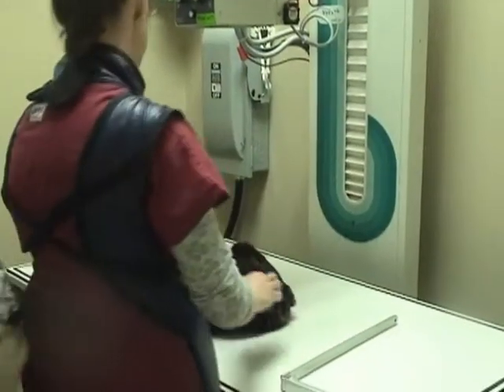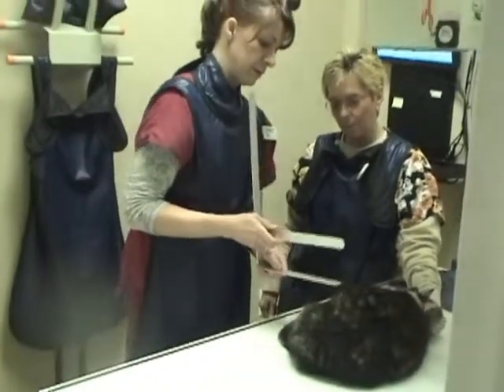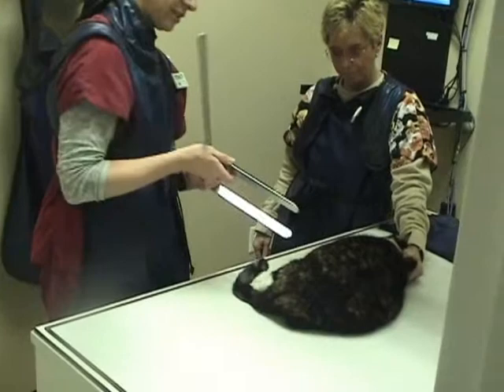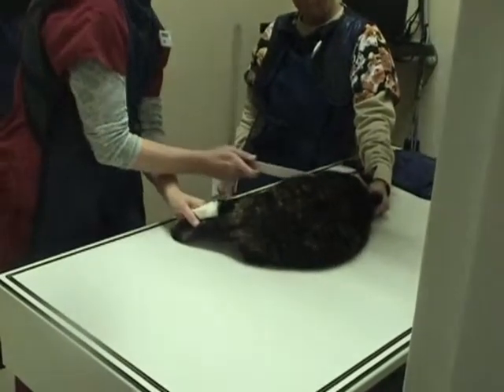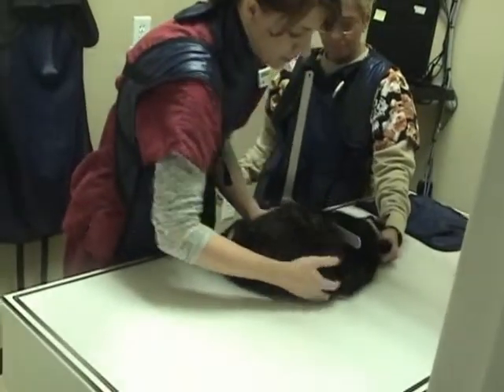If a patient presents with vomiting and diarrhea, and medical management has failed and survey radiographs are inconclusive, a contrast study may need to be indicated. X-rays are taken at intervals to evaluate changes in morphology, the rate of gastric emptying, and small bowel transit time.